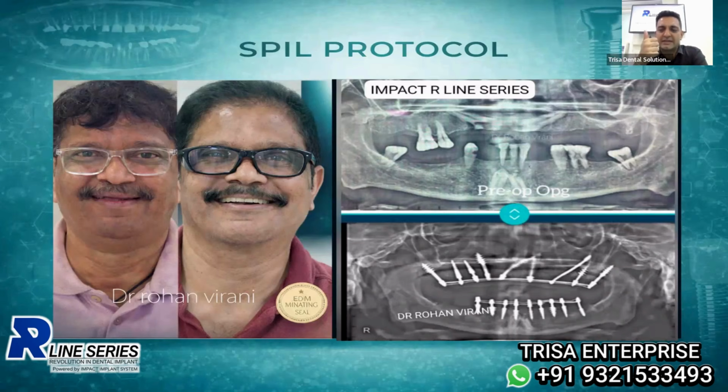So similar case, immediate loaded, similar protocol of single drill, but with the option of basal implants, single drill, intraoral welding.